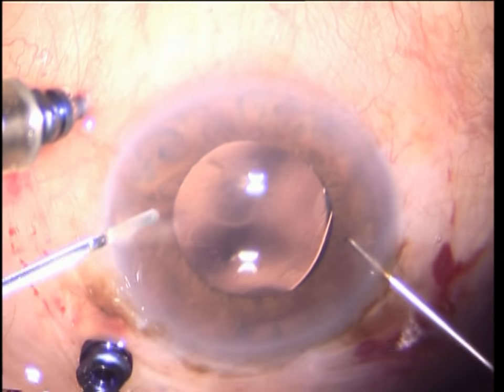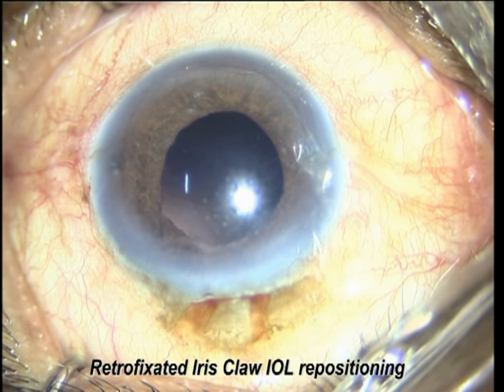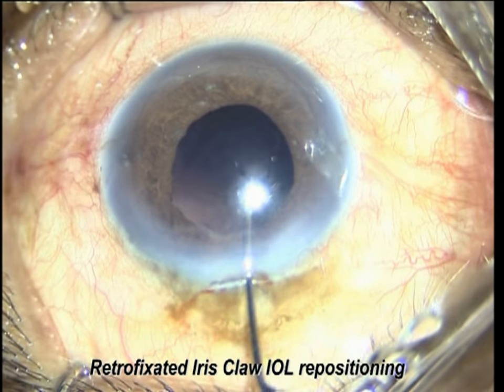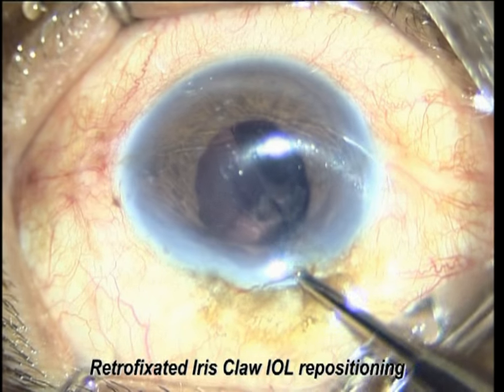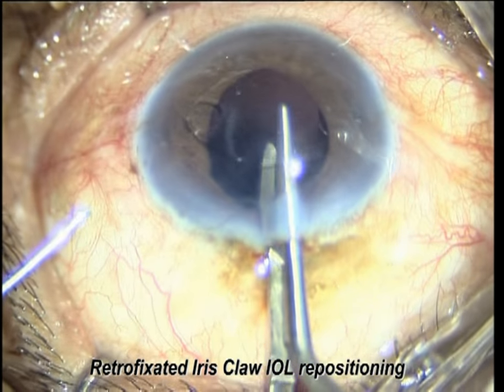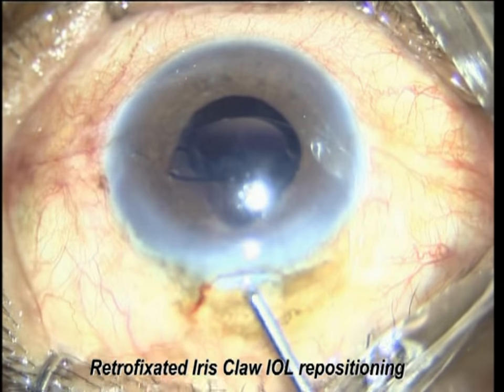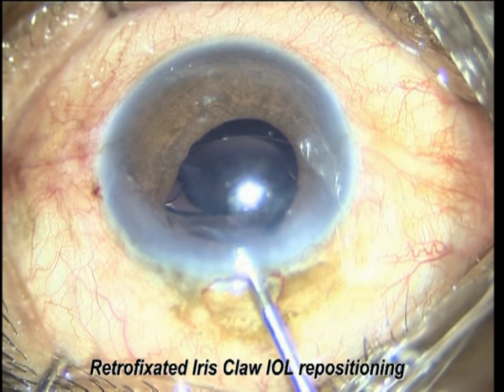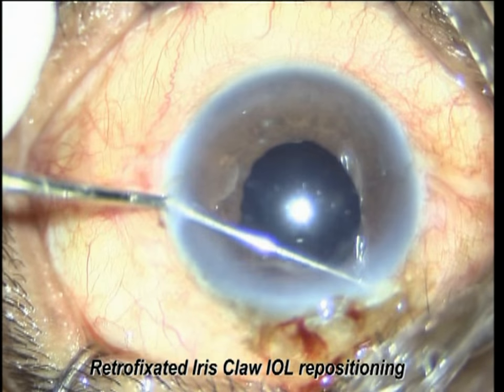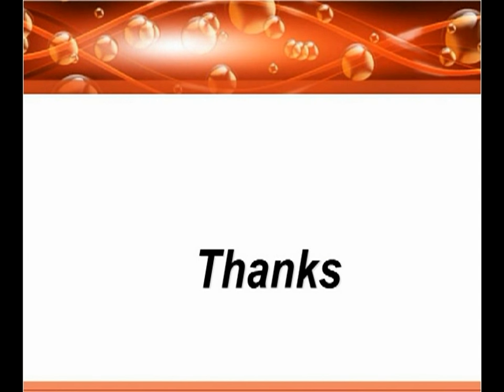This is the case of a dislocated iris claw lens that has dislocated into the vitreous cavity. Just hold it, bring it into the anterior chamber, go retro-iris, and perform retro-iris fixation of the iris claw as we normally do.